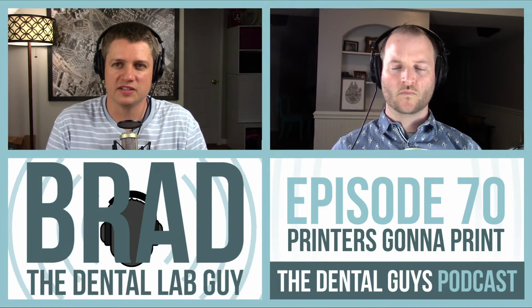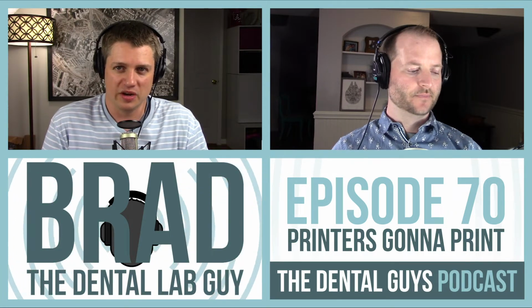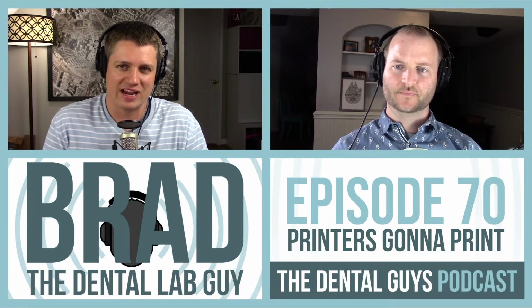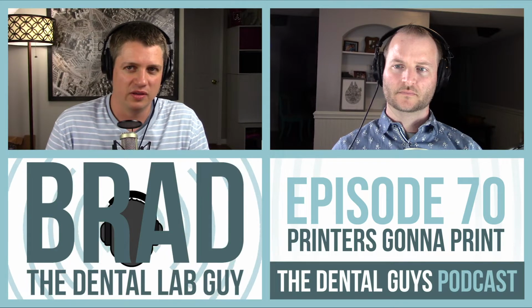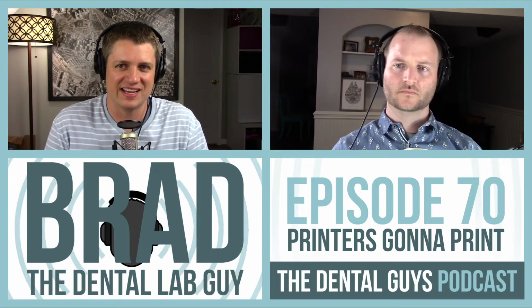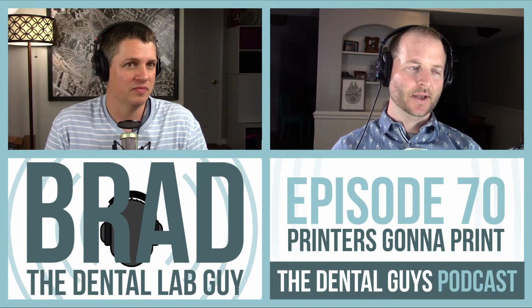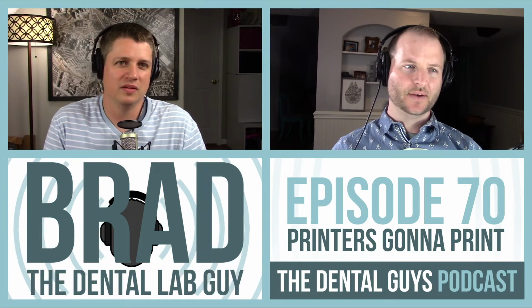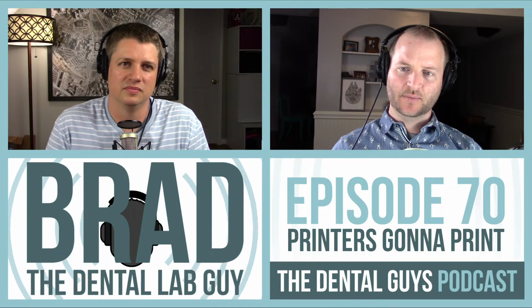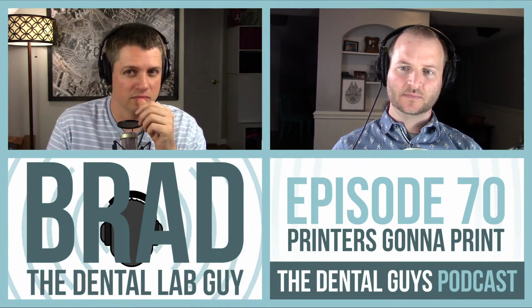Okay. And we're still assuming that stone is the gold standard, which research says it still is when done properly, as the most repeatable and most accurate way to come back to the mouth. In most situations, you're about 98% of the time hitting that. Correct. Yeah. Okay. And I think that's interesting to hear. Let's go back to when you first got into the technology, Brad. I know you don't have exact numbers, but where do you think it was just a few years ago on accuracy?